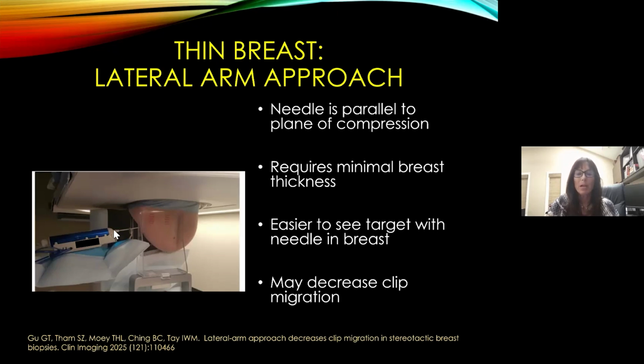Here, because the needle is parallel to the plane of compression, you can be successful in targeting this patient even if the breast thickness is minimal. You don't need a lot of space between the paddle and the detector in order to get the needle in there. It is easier to see the needle in the breast adjacent to the target. I'll show you an example, and this may decrease the accordion effect.